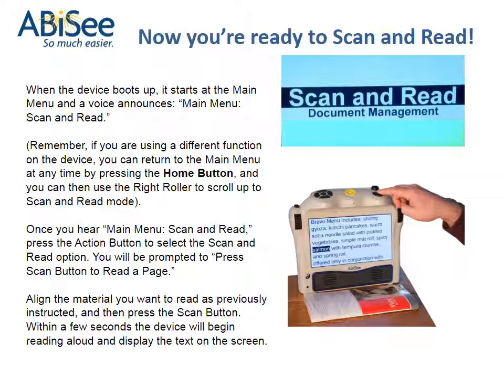Align the material you want to read as previously instructed, and then press the scan button. Within a few seconds the device will begin reading aloud and display the text on the screen.